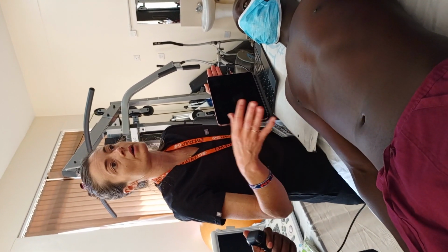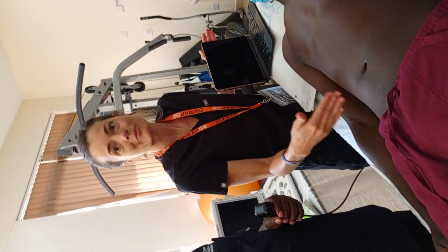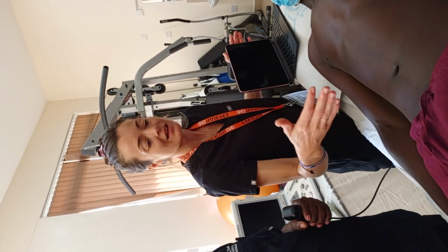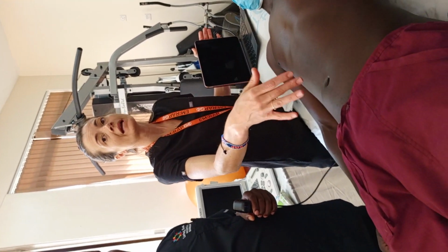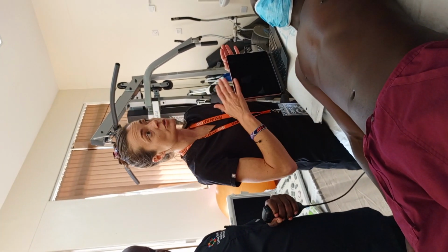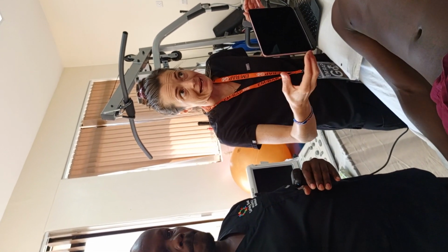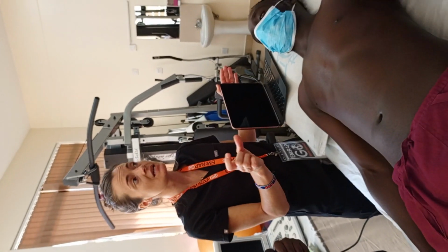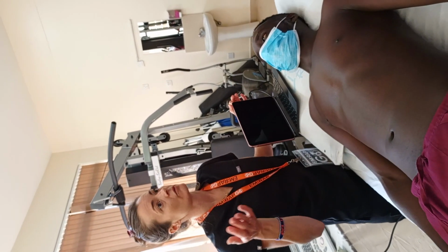Now, if this was somebody with chronic alcoholism and had liver cirrhosis for whatever reason, ascites would also give you a positive FAST, but that isn't in the setting of trauma, so I'm not so worried about internal bleeding. And then the 4th place is suprapubic, where you're going to look at the bladder, and we're looking for any free fluid outside the bladder wall. Now, any fluid in the body on ultrasound is going to be black. When you look at the bladder, you're going to see black in the bladder wall. That's urine. We know that that's supposed to be there. But any black that we see, any pocket of fluid that we see outside of the bladder in the setting of trauma is very concerning for bleeding.